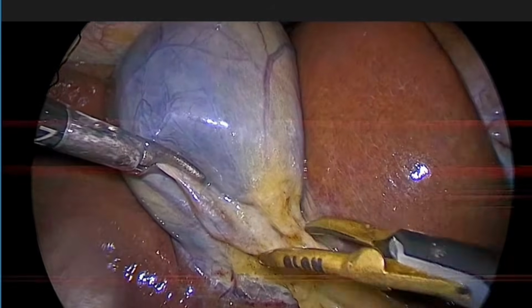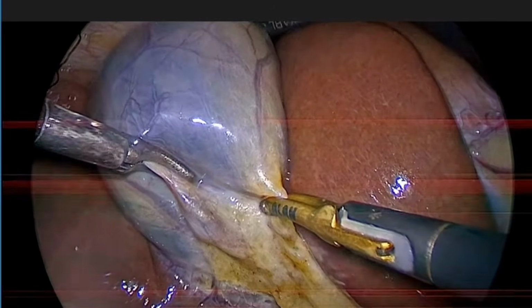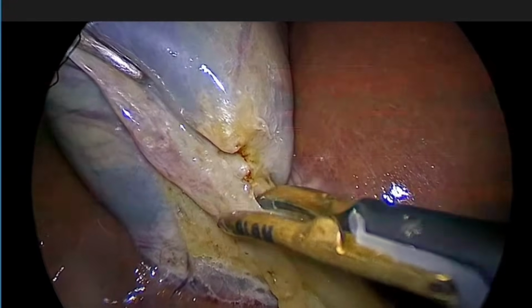Now, this is the lymph node. We will divide the vessel on the gallbladder wall here. We are using ligature. You see, vessel is divided.